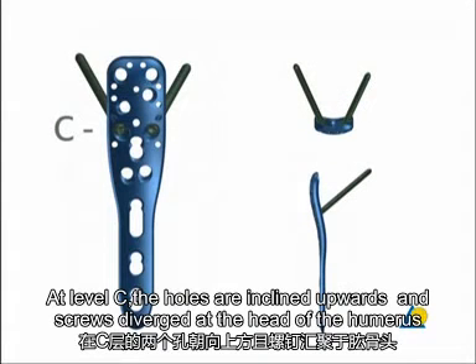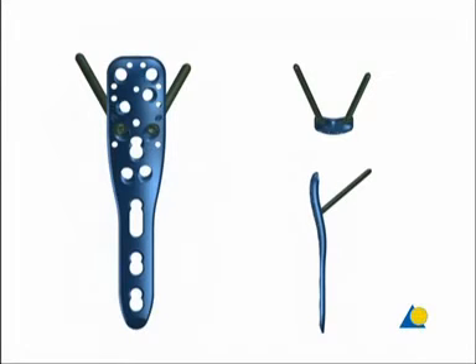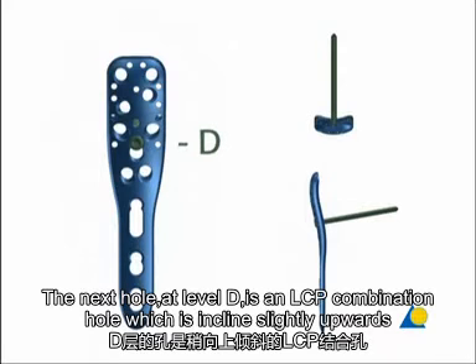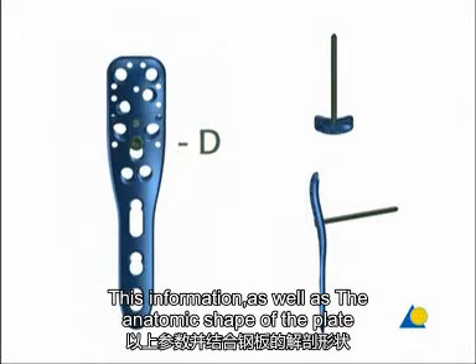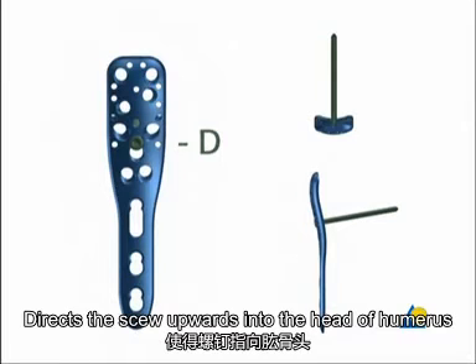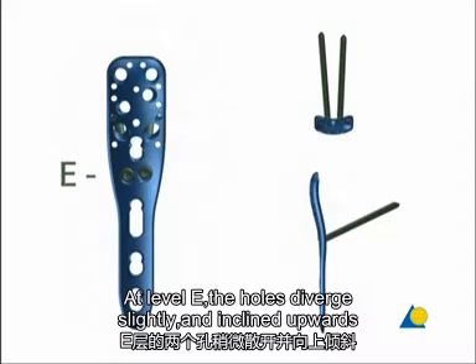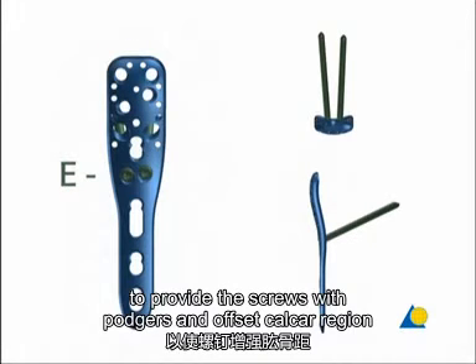At level C, the holes are inclined upwards and the screws diverge in the head of the humerus. The next hole, at level D, is an LCP combination hole which is inclined slightly upwards. At level E, the holes diverge slightly and incline upwards to provide the screws with purchase in the opposite calcar region.